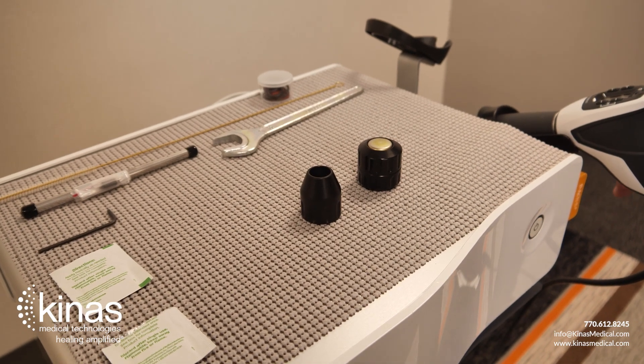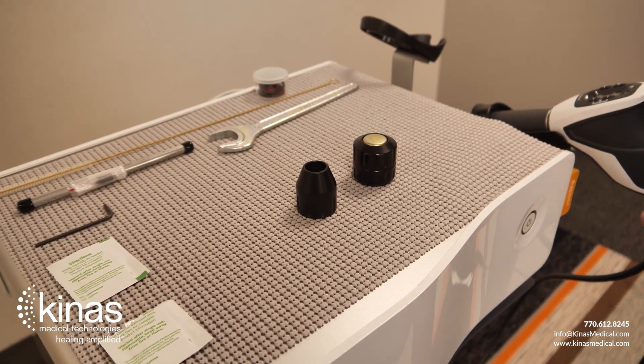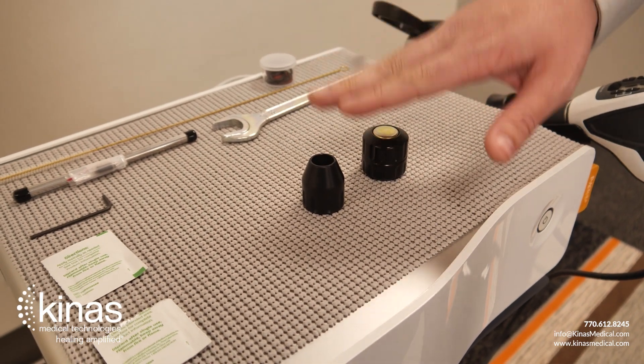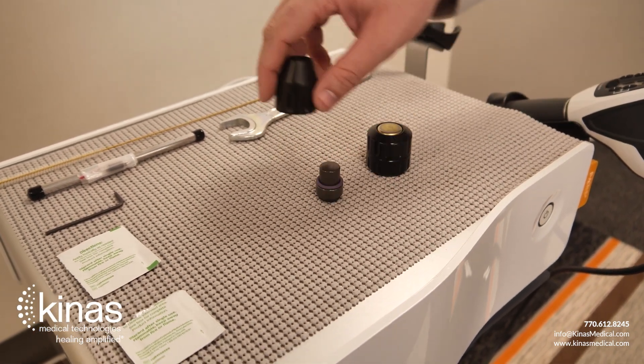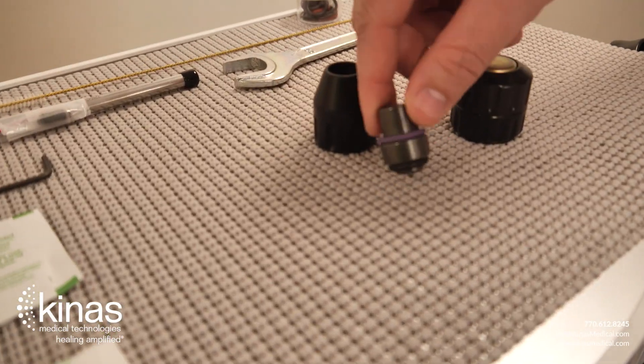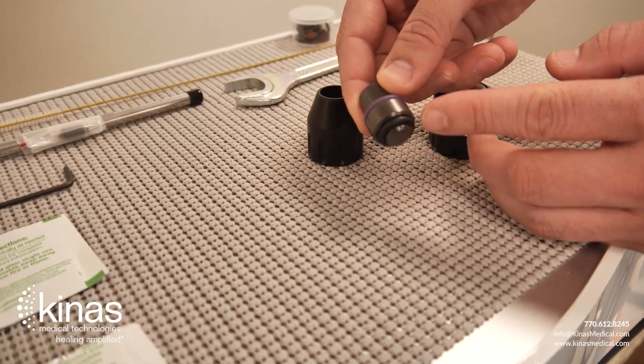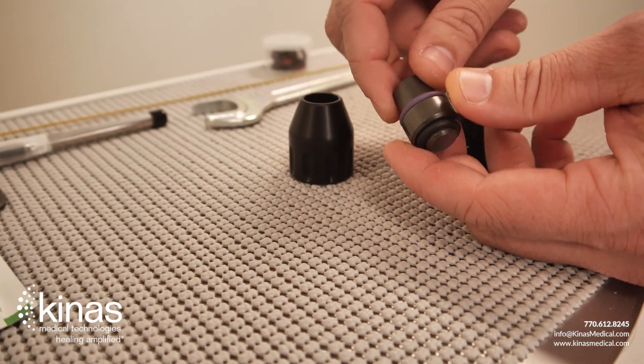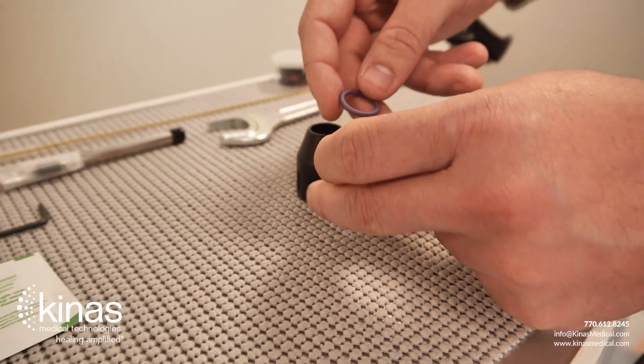When cleaning your handpiece equipment or doing your routine maintenance, you always want to check the O-rings on the transmitter tips. So on the C-15 here, there is a black O-ring on the bottom and a purple O-ring. You just want to occasionally take these off and clean them.